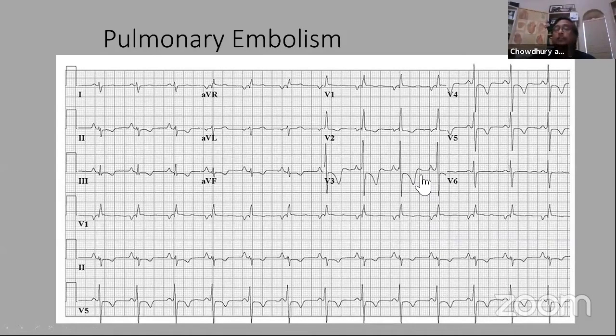That can give you this EKG pattern. The ER, emergency room physician may be worried with the ST depression, ugly, and they will call you. They don't see any ST elevation, but it's ugly looking, but you need to figure this out.